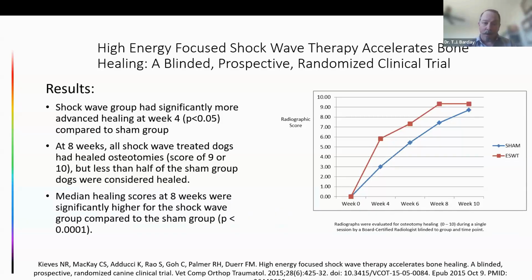The treatment protocol on these was 2 shockwave treatments. The first one was performed immediately after surgery, and then the second one performed 2 weeks later. And that's really based on the 2 TPLO studies that we've talked about so far, and another one that we'll discuss later. That has become the standard protocol for TPLOs: a first treatment immediately post-op and a second treatment 2 weeks later.